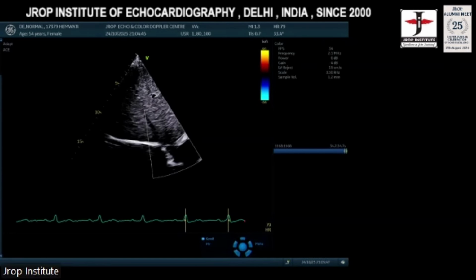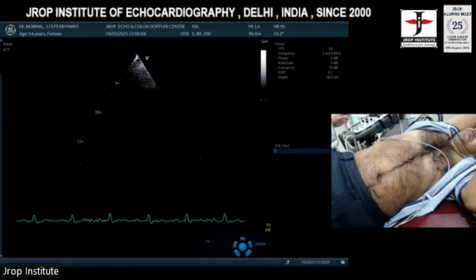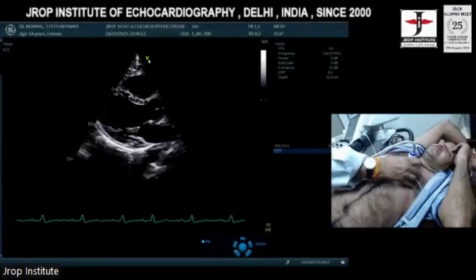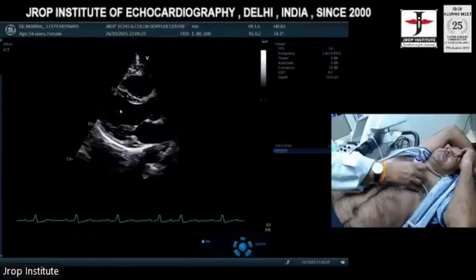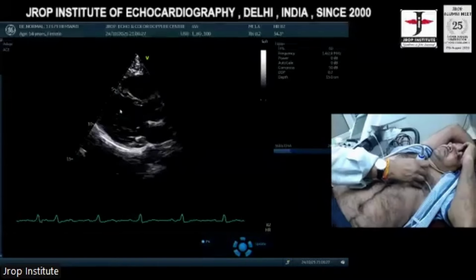Dr. Arya, roll number 2. Sir, how to adjust the grayscale? And you told in the WhatsApp group that the American convention is that the LV and LA are on the right side of our screen, but actually it is on the left side. How did you adjust that? I'll show you. Just look at it. If you look at the screen over here, this is the V, correct? It is kept on the right hand side of the screen. This is aorta, LA, LV, correct? Now I'll go from left to right.